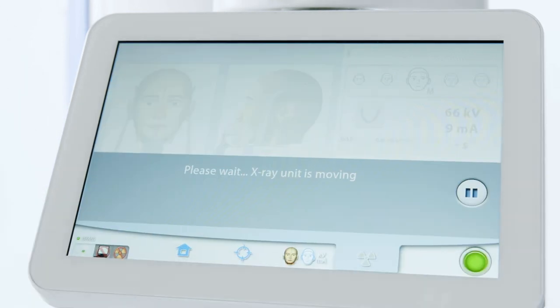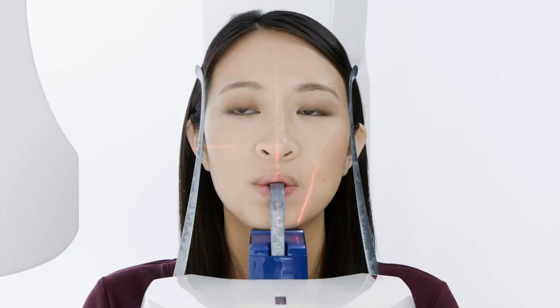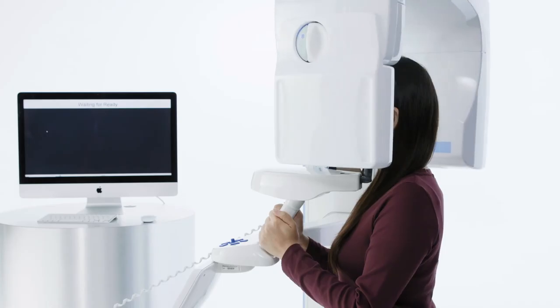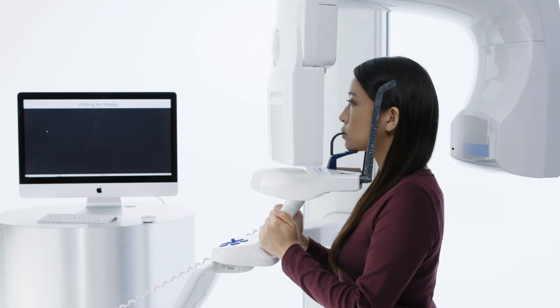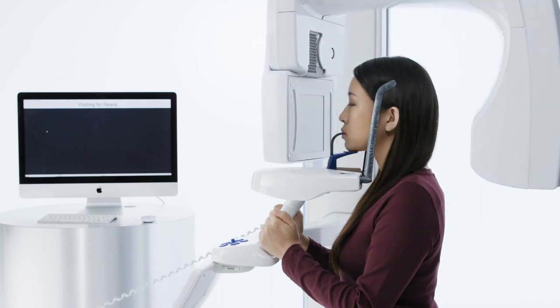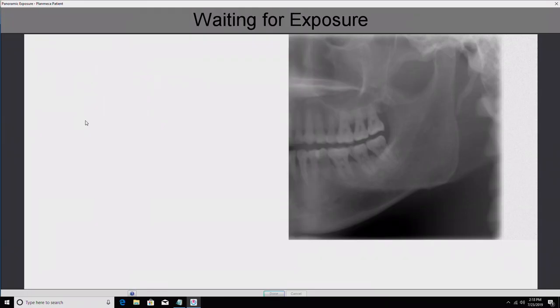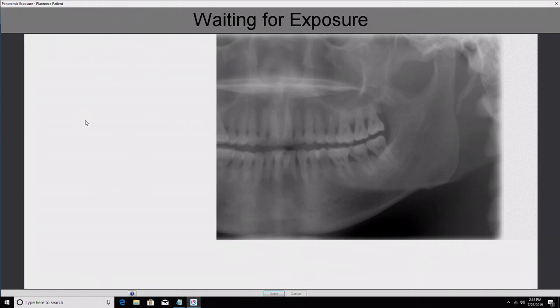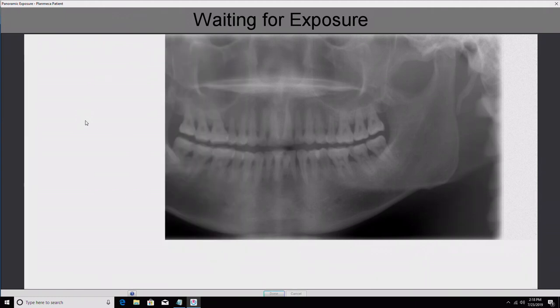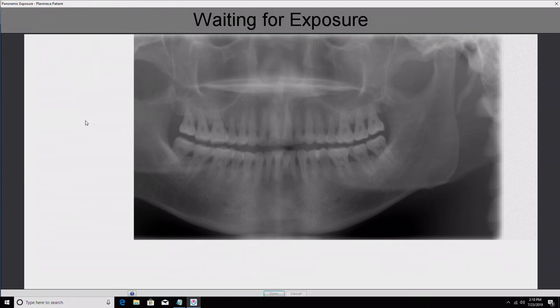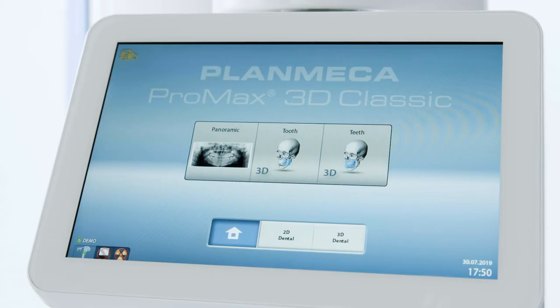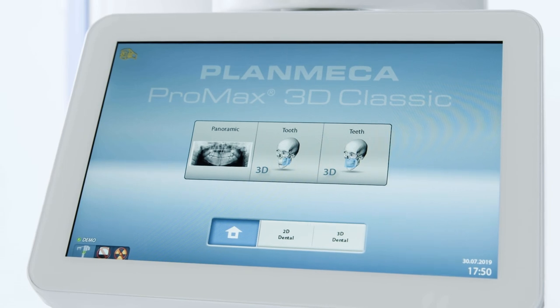Press and hold the exposure button until all audible noises cease. The image will appear on your computer screen. If your imaging software requires you to save the image, press OK or done where applicable.